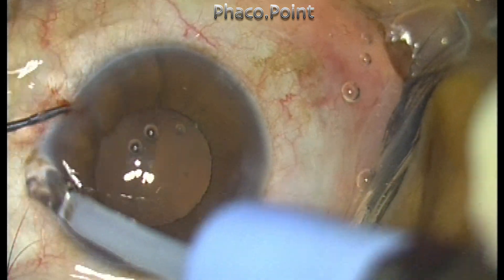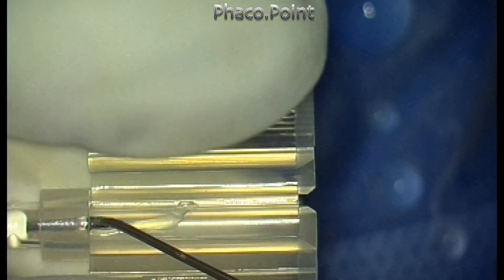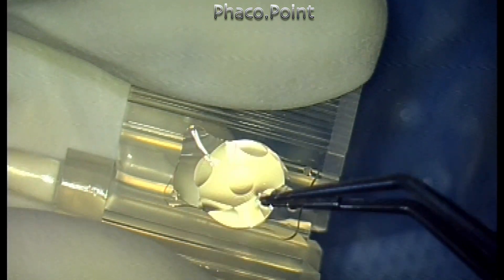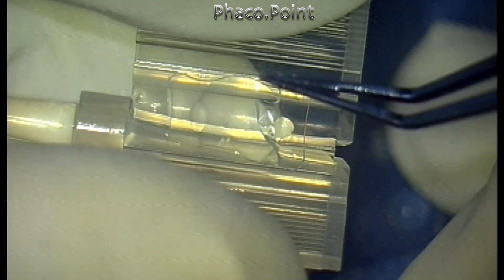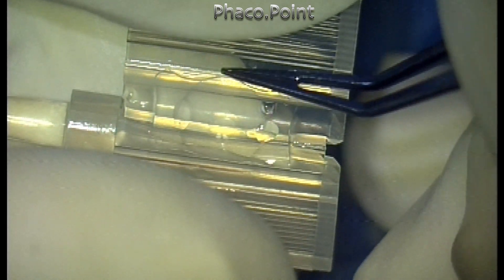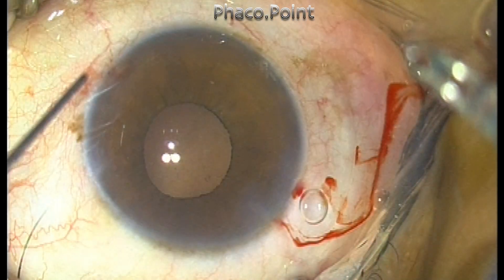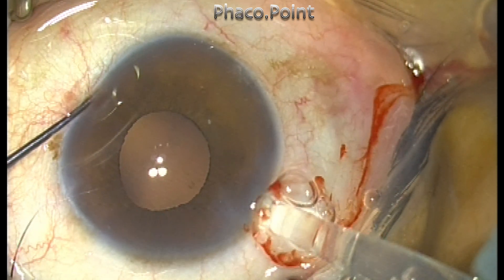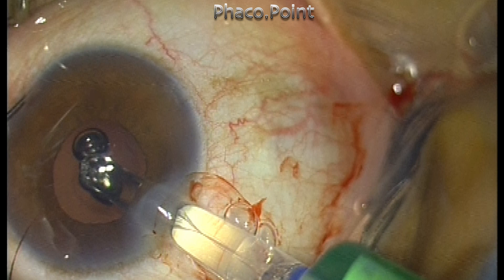The patient is going to receive an AT-LISA multifocal implant, and this is the way it is loaded onto the butterfly cartridge. Just make sure that the perforation on the haptic is to the left as you load this lens into the barrel of the butterfly cartridge. The injection can also be performed in a single-handed fashion. Note that in plate haptic lenses especially, once you get half the plate inside the bag, as the plate unfolds, the rest of the lens will automatically slip into the capsular bag, which is what happens in this case.